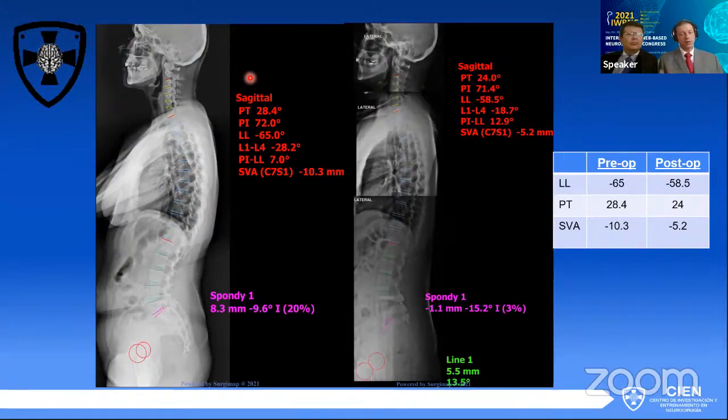And in this case, if you can see, and it's quite evident in both the left and the right image, the profile changed and the tilt improved. And the tilt is the numerical way that the patient is telling us that the pelvic retroversion changed. Although in part, that is also generated by the change in the L5S1 disc. So this is what it is showing us. She's not in a perfect balance state, but she has a reduced compensation due to surgery, and that's what we wanted.